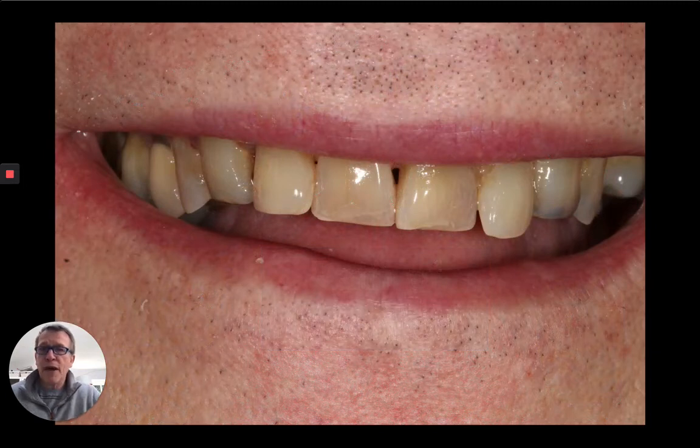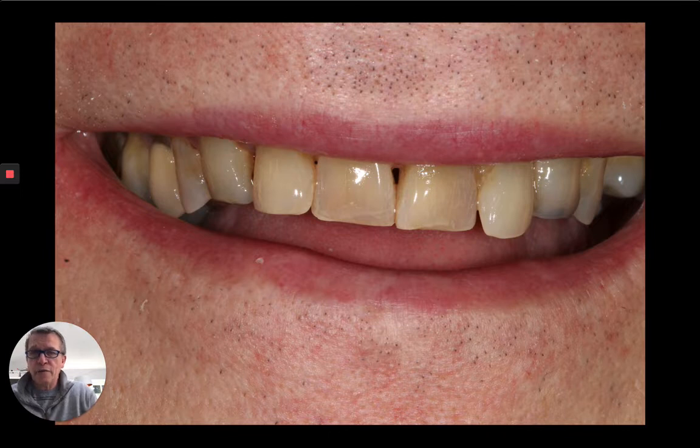If we look at his smile, he's got typically what you might call a little bit of a reverse smile, the lower right side hanging down a little bit, front's a little bit short perhaps. On the left side, we've got a space, so we've got a bit of negative buccal corridor, all the things that we look at. But if we look at the upper left lateral incisor, and maybe even the right lateral incisor, in a nice natural case like this, we could pretty much accept them as landmark teeth for us, and maybe make everything else match in with there.